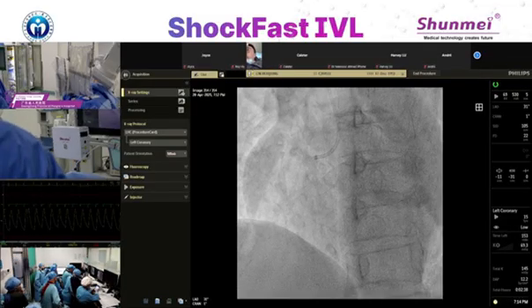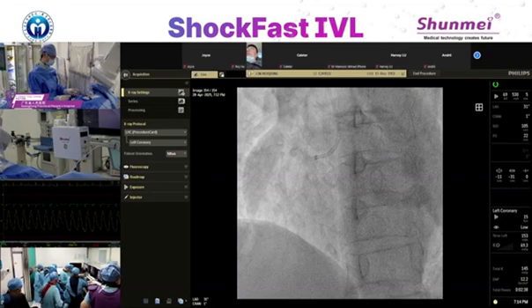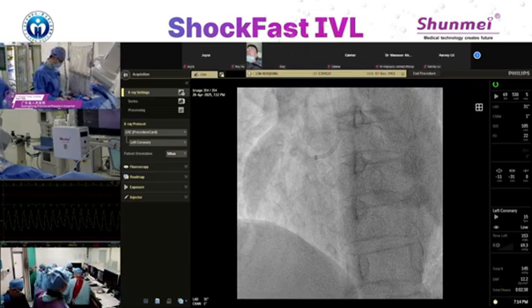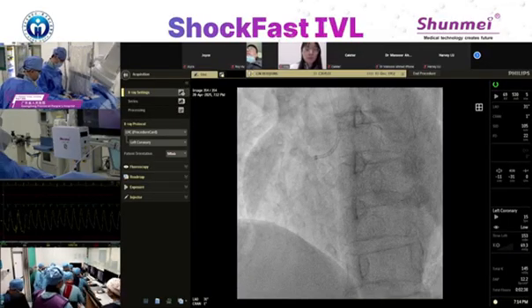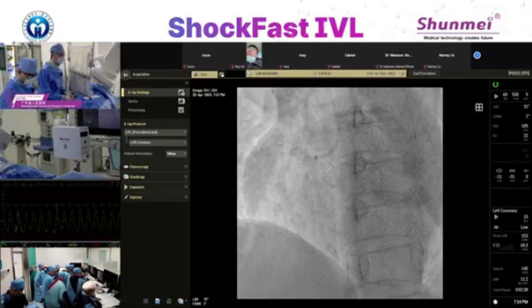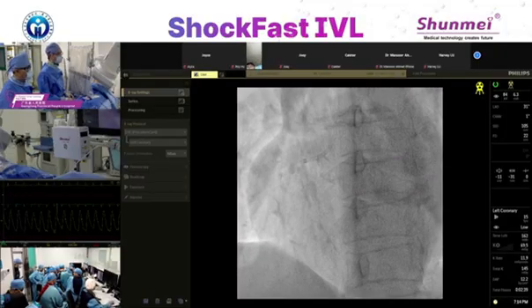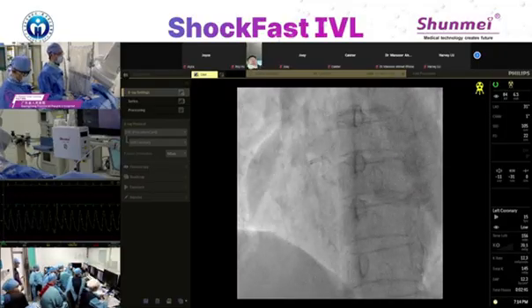So I'm going to get some nitro. She feels nothing uncomfortable, but a little bit of itch on the face, but really nothing. The skin looks good. It doesn't seem like an allergy.